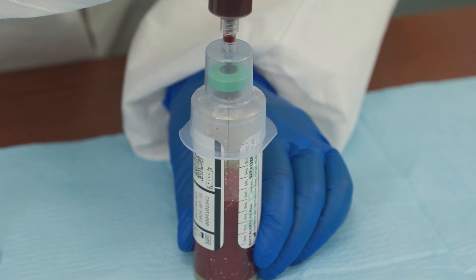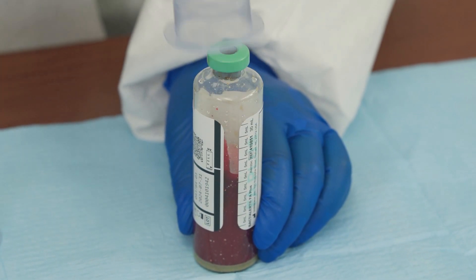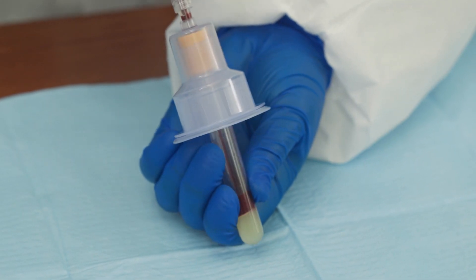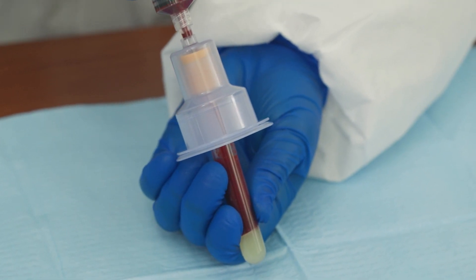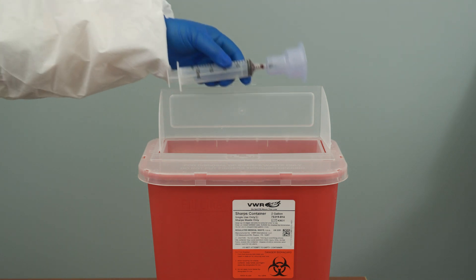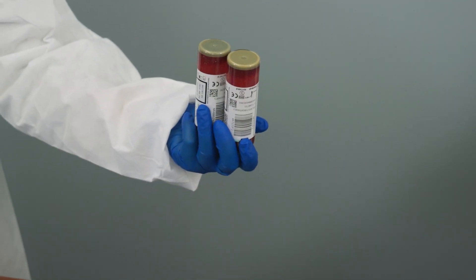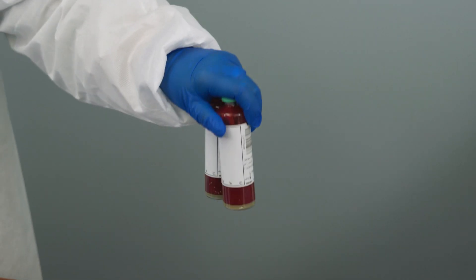Use the fill tube mark to accurately gauge the sample volume — 10 milliliters per adult bottle. If other blood tests are required, always inoculate the blood culture bottles first. Discard the syringe and adapter into a sharps container and dispose of other materials. Mix blood culture bottles and tubes by inverting three to five times.